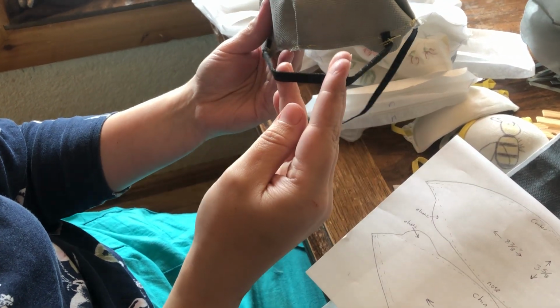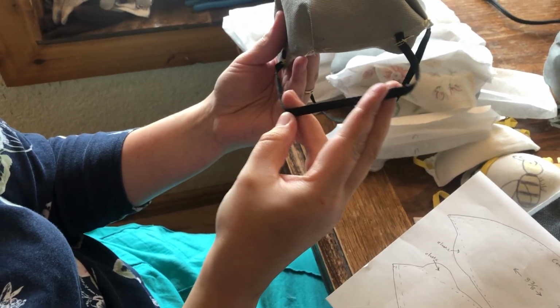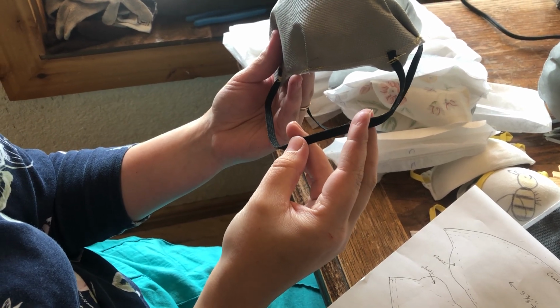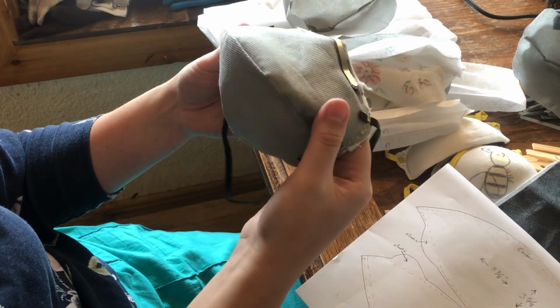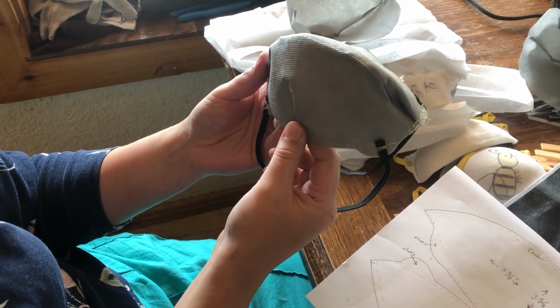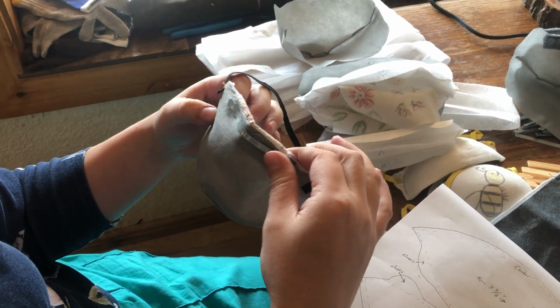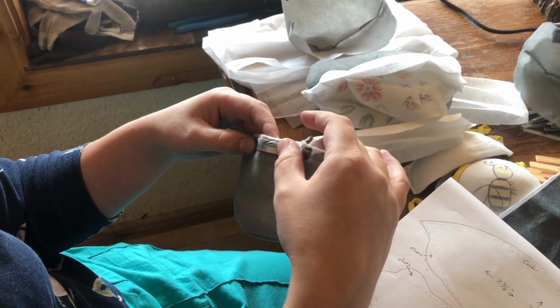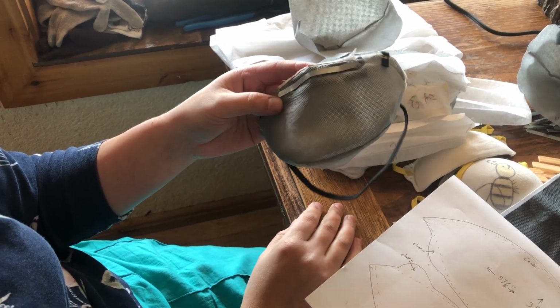This elastic, I bought the white elastic and I ripped it up the middle. It will delaminate with time, but time is important. So I can't wait for more elastic to come into the store. I just have to use what I've got. So you put your elastic on, you pleat your sides. If you want to pleat the chin, I recommend making one and trying it for yourself. See what you think and make your little adjustments on yours, and then decide what you want to do. And once you make one mask, wear it while you make the others. Yeah, wear your mask. So then I hot glued the metal onto the nose piece.